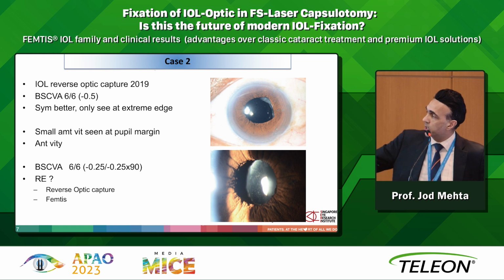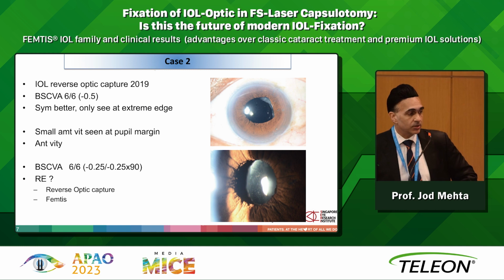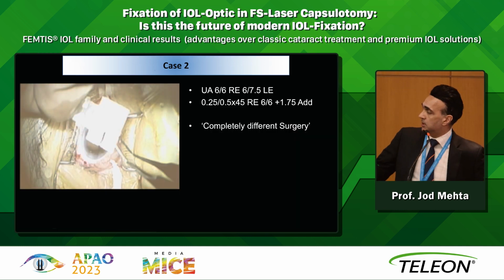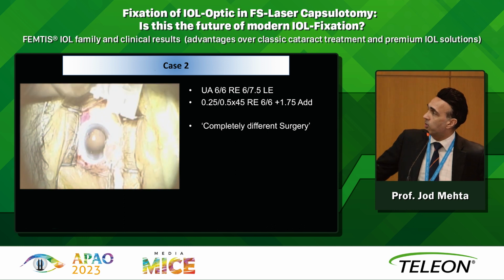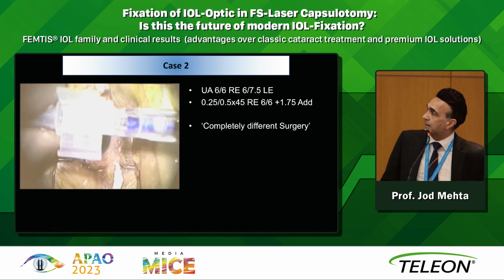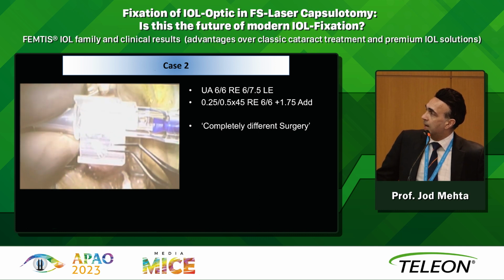Okay, I said to him, why don't you try this lens instead? It works on a different technology. We can clip it to the anterior surface. Okay, so the lens is exactly the same. I've already created the capsulotomy with the laser. Again, just checking with the haptics, with the positioning.